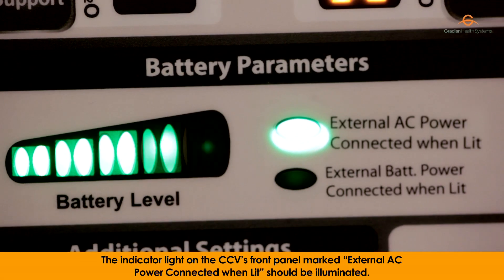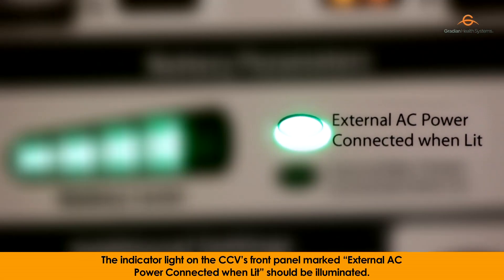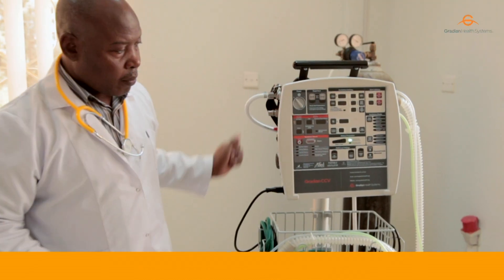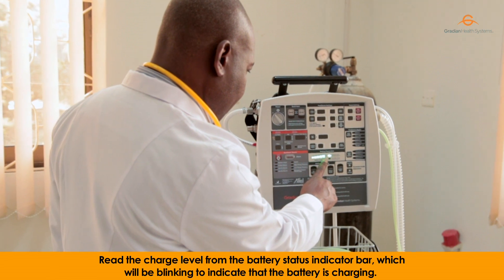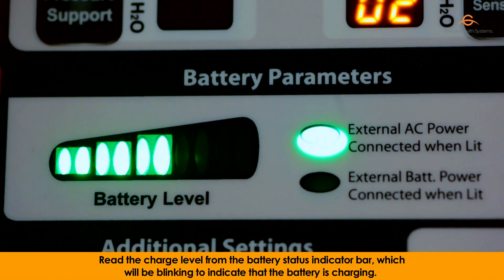The indicator light on the CCV's front panel marked "external AC power connected" should be illuminated. Read the charge level from the battery status indicator bar, which will be blinking to indicate that the battery is charging.